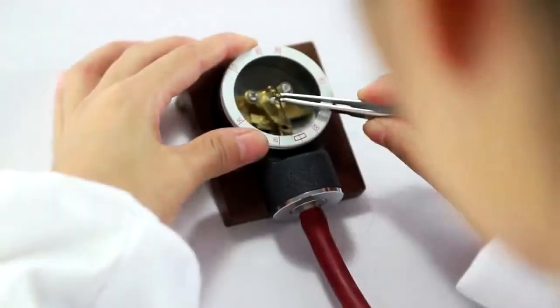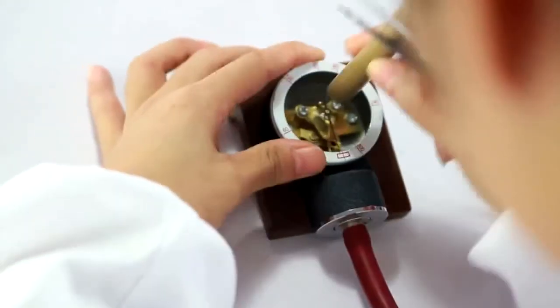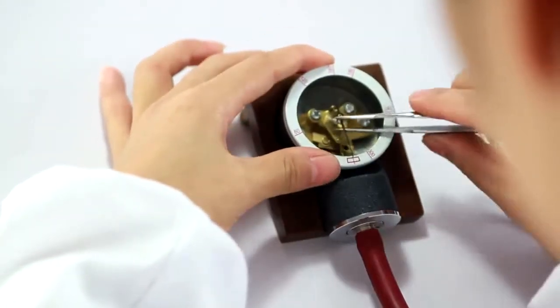We calibrate our gauges five times before they ever leave the factory, and it's important to point out that we calibrate at five different points along the dial. Just because the gauge is calibrated at zero doesn't necessarily mean that it's calibrated at 60, 120, 180, 240, and 300. So our expert craftsmen take the extra care to make sure that our sphygmomanometers are calibrated at each of these five points.